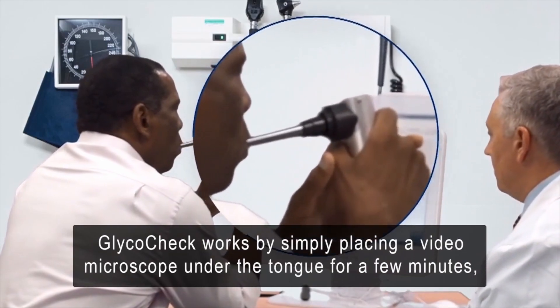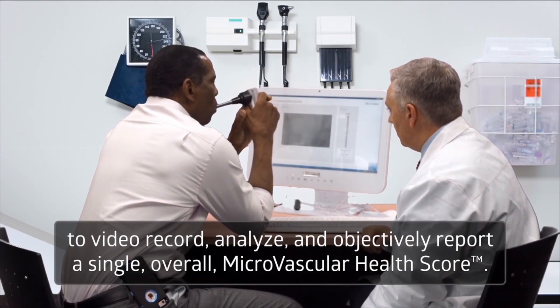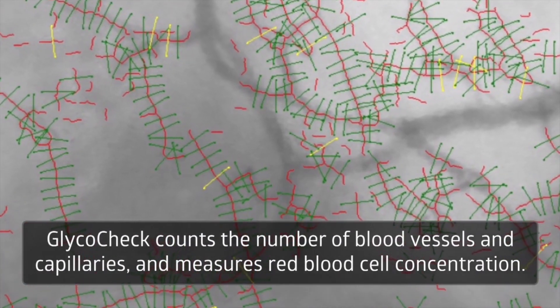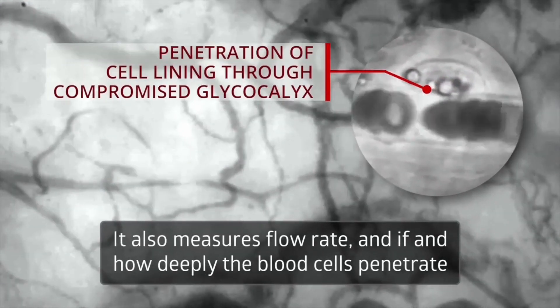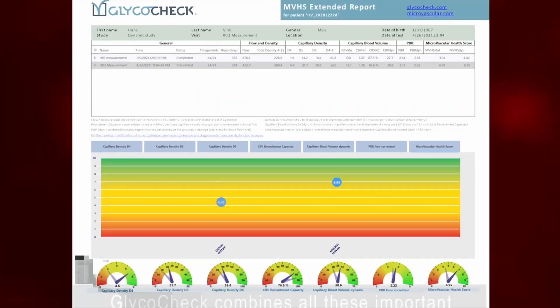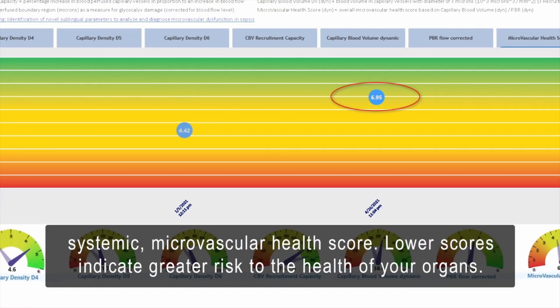GlycoCheck works by simply placing a video microscope under the tongue for a few minutes to video record, analyze, and objectively report a single overall microvascular health score. GlycoCheck counts the number of blood vessels and capillaries and measures red blood cell concentration. It also measures flow rate and how deeply the blood cells penetrate into the protective glycocalyx gel lining, a sign of deterioration. GlycoCheck combines all these important measurements together to generate a single systemic microvascular health score. Lower scores indicate greater risk to the health of your organs.